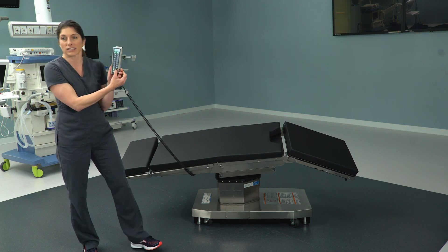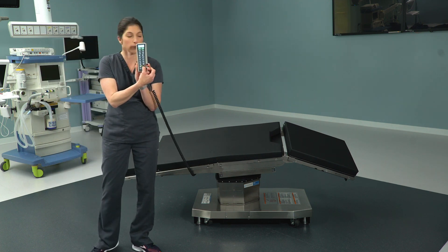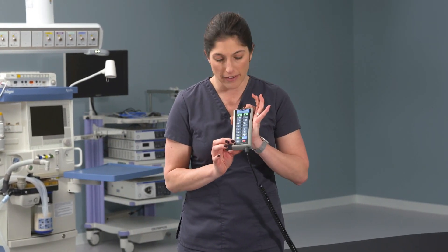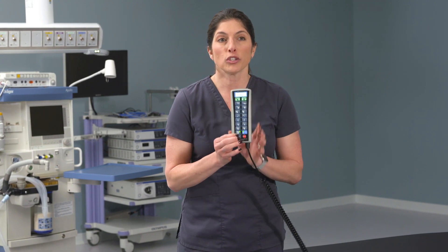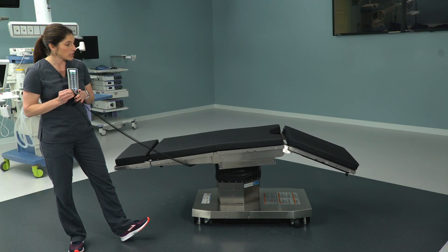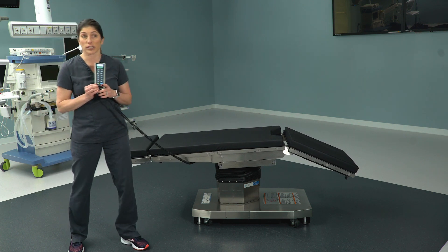It'll confirm that it's locking. Everyone's favorite button on the 3085 — we also have on the 5085 — and that is the return to level. Press and hold return to level and it will return the table and the patient back to level in the most ergonomically correct manner.